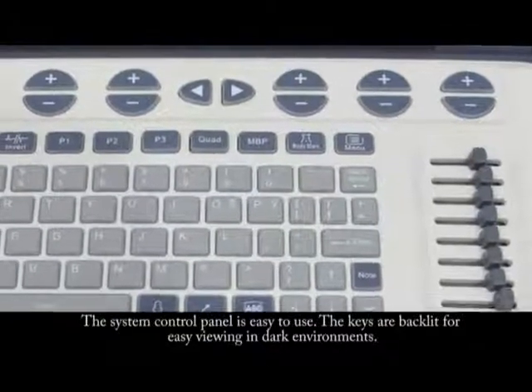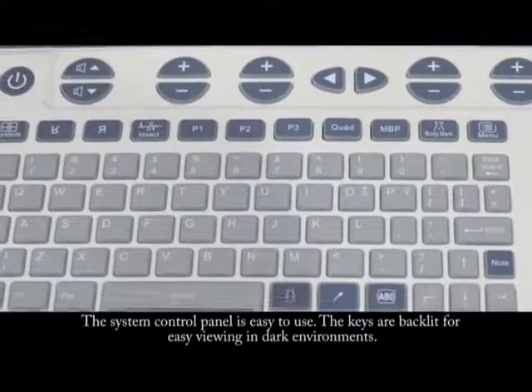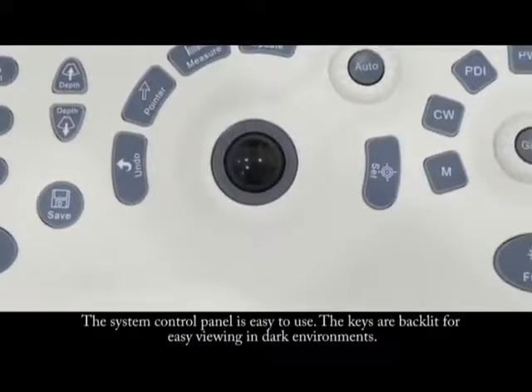The system control panel is easy to use. The keys are backlit for easy viewing in dark environments.